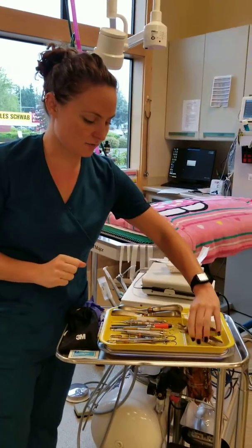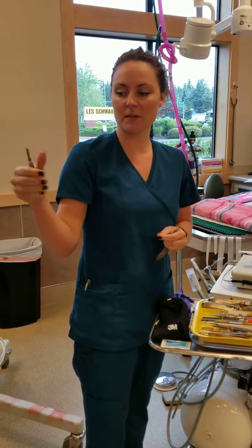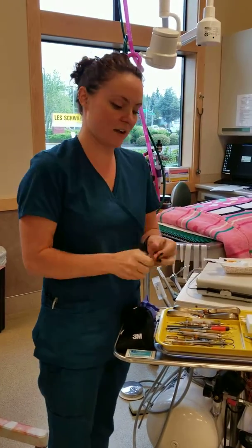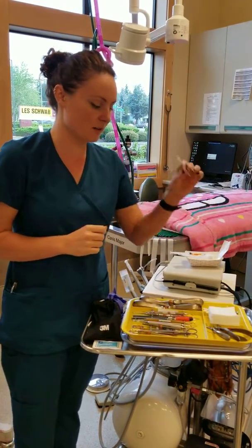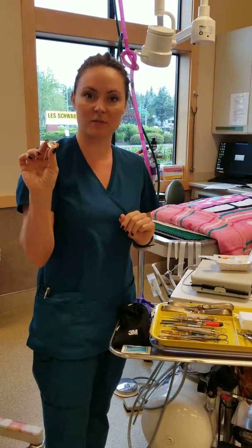Over here we've got our calculus scaler to manually remove calculus from the teeth. Then we have extractors here for the doctors to use for extracting teeth. Last we just have some gauze, some cotton tip applicators, and then our prophy paste for polishing the teeth.